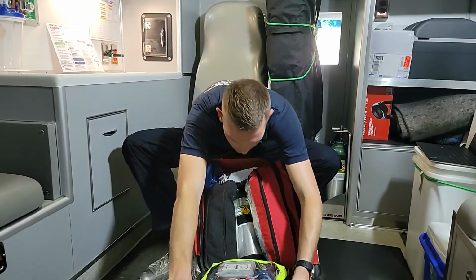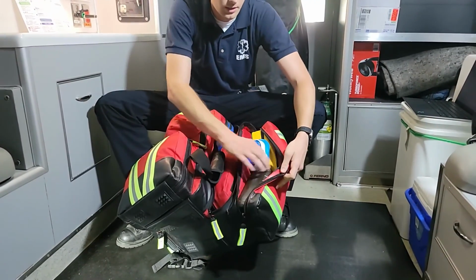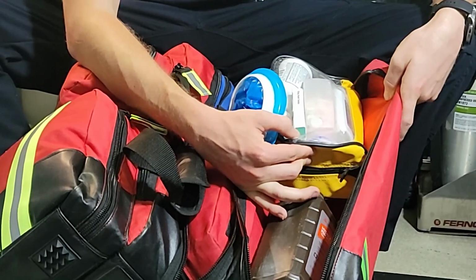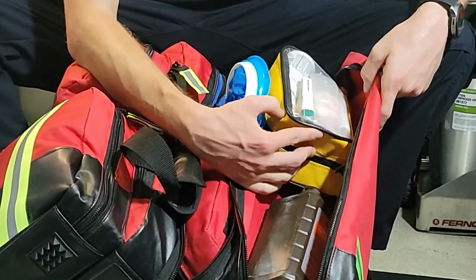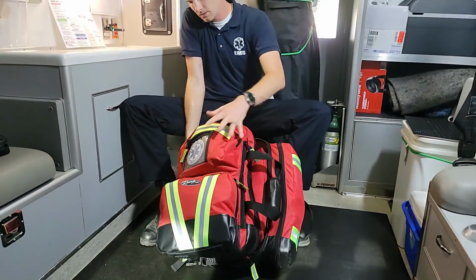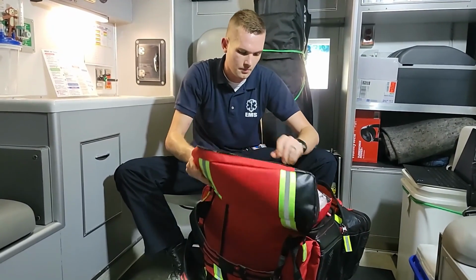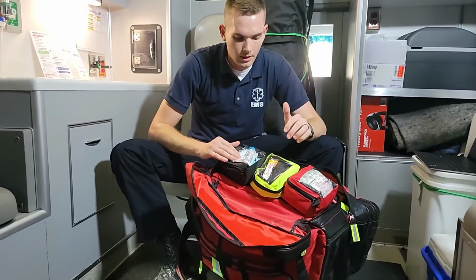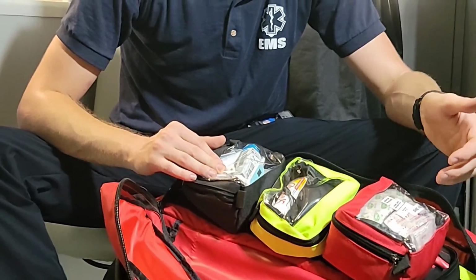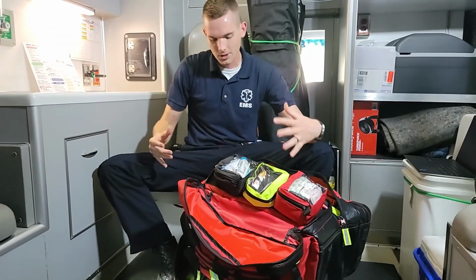My side packs over here, this is where I keep my more routine, usual minor issues. I've got hydrogen peroxide, some eye wash, OTC medications, sting relief, things of that nature, aspirin. And on this side, open it up. I've got my thermometers, space blanket, glucose, glucometer. This is going to be minor trauma. So you've got tweezers, Band-Aids, Neosporin, things of that nature. Sorry, it's a little hot in here. So minor stuff on the sides, major in the middle.